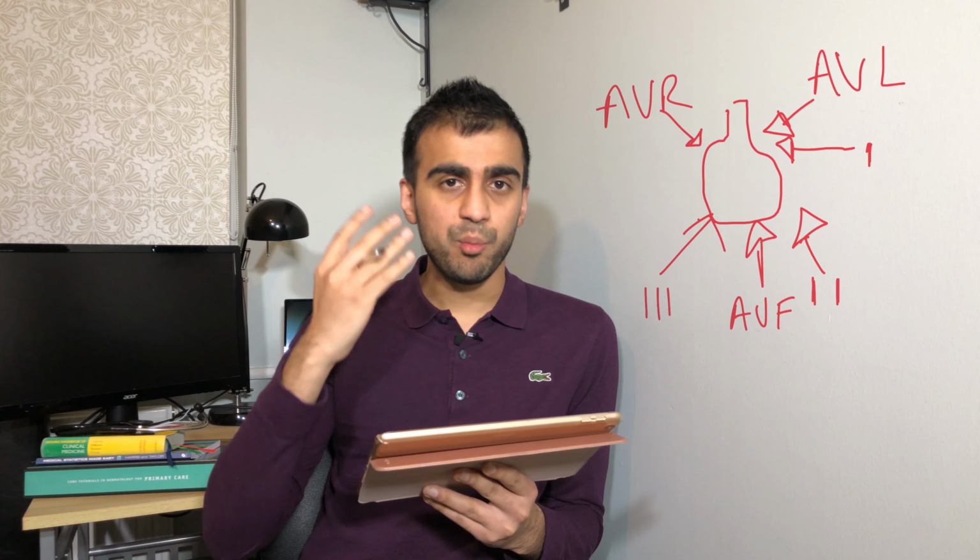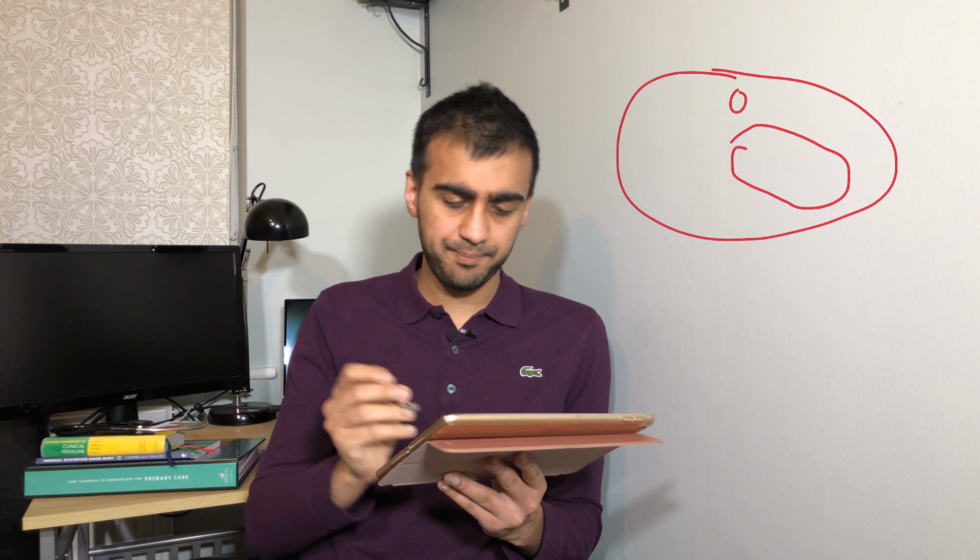Right, moving on, then we need to talk about the chest leads. So chest leads are really easy. If you know how to do an ECG already, then you've already come across how you put the leads on. So essentially it's exactly the same thing, and I apologize for my drawing once again, but if we say that's a kind of transverse section through our chest, we have a vertebra at the back, and the heart will sit something like that.